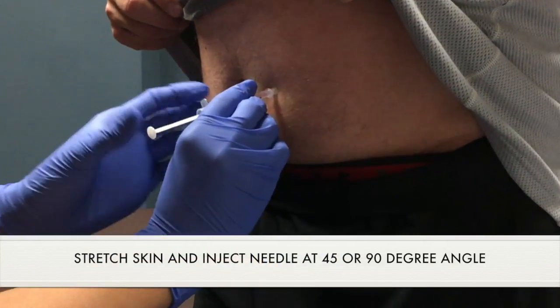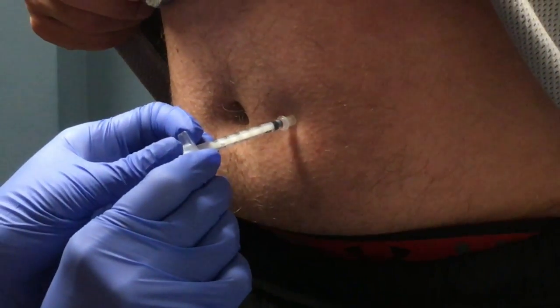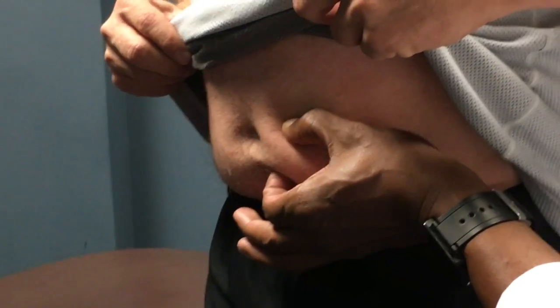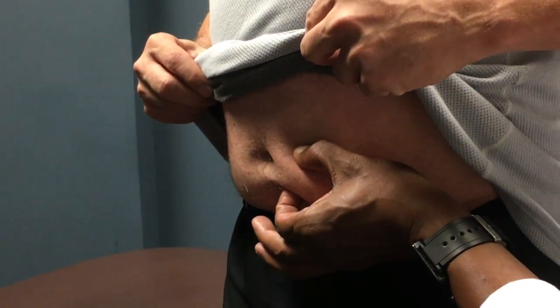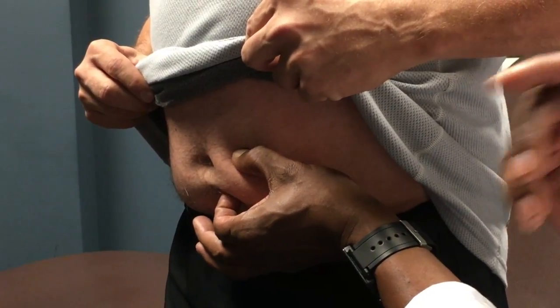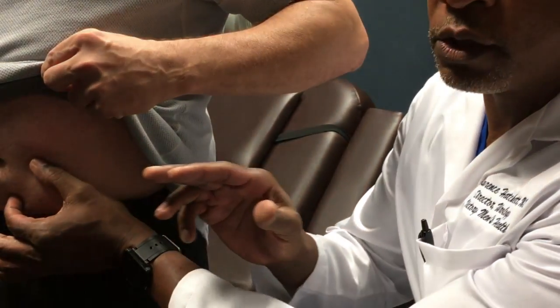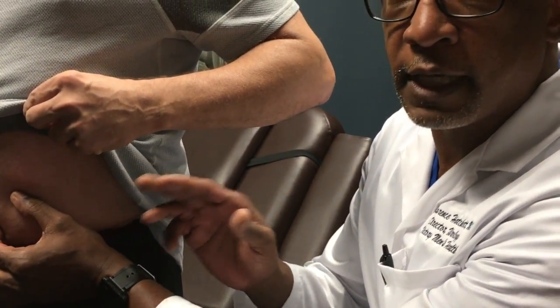If you notice here, she's spread the skin and just put a stretch on the skin before doing the injection. The important thing about doing the stretch versus pinching is that sometimes when you pinch and do the injection, the harder you pinch the skin, the harder you have to inject — and the HCG can be injected too superficially, which is what causes the bruising. So the key point is: put a stretch on the skin, do the injection so it's deep enough, and you'll have less pain and less bruising.